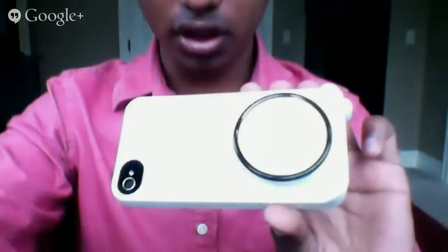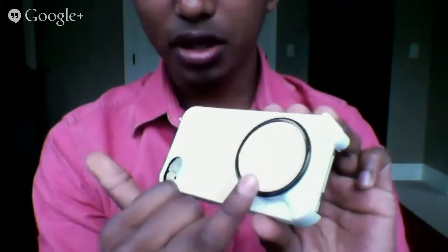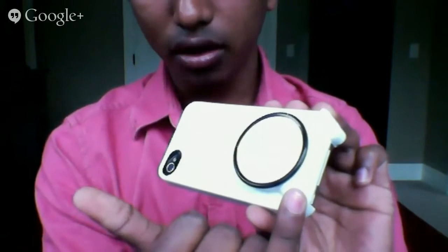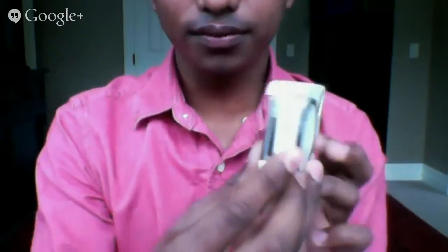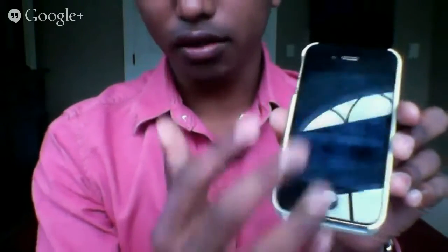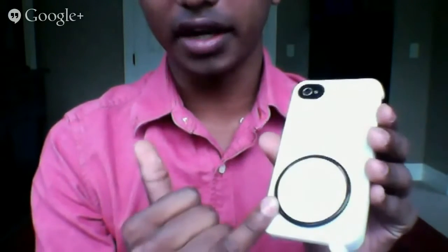This is the device itself, and it may be a little bit difficult to see due to the washing out from the light. But what basically happens is you have a diaphragm here, and then underneath, inside this case, is a tube, and that tube actually mates with the microphone of the smartphone, right there. And so all it is is a case that you slip the phone into, and by doing so, you allow the usage of the microphone of the phone to listen to the heart sounds collected by the diaphragm.